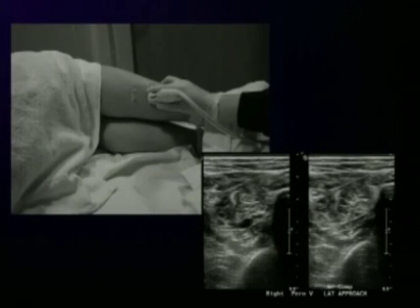When that doesn't work, or when you cannot image deeper structures, you may try a lateral approach. And here you see the patient now lying on their side, and you can access the peroneal veins and bring them closer to the transducer.